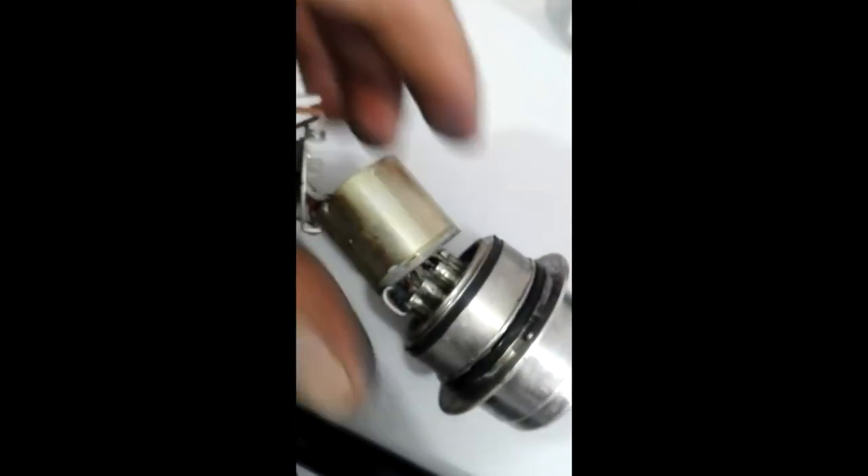Na outra extremidade vemos toda a fiação elétrica e óptica, tanto da câmera quanto da conexão do emissor e gerador de luz, proveniente da fonte de luz.